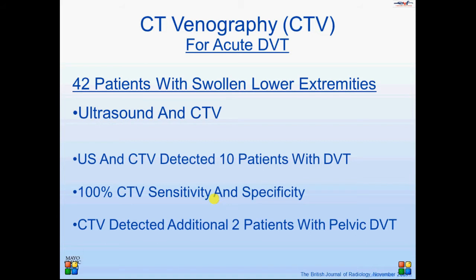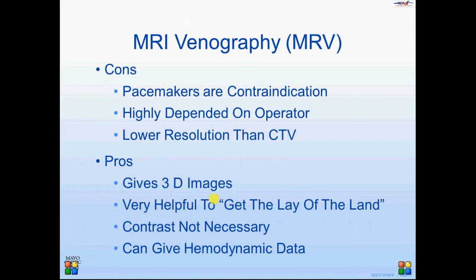So what do we know about the diagnosis of deep vein thrombosis with CT? Very little, really. Ultrasound has really replaced ascending venography, as I talked about before, and CT hasn't really caught up for many reasons. This is a study from quite a while ago that demonstrated that you can actually use CT to detect deep venous thrombosis of the lower extremity, and it does also help in detecting DVT in areas where ultrasound is not applicable, at least not in all cases.